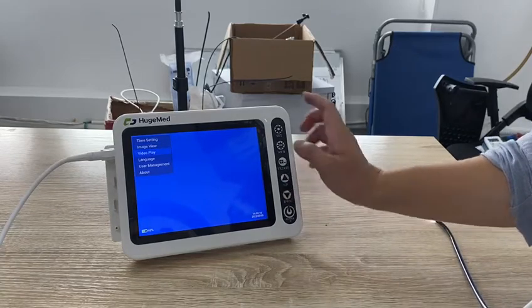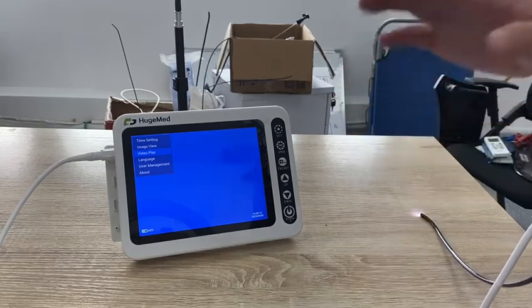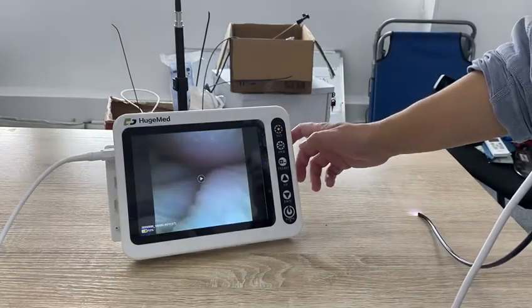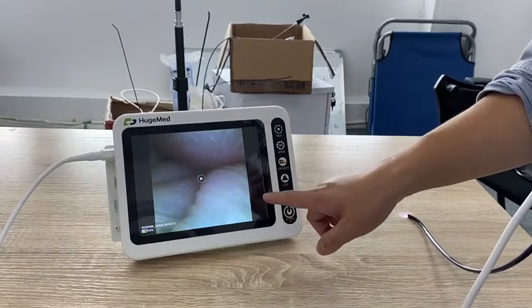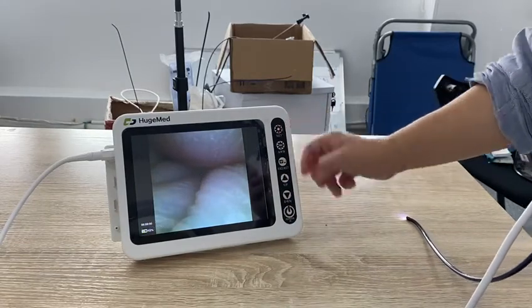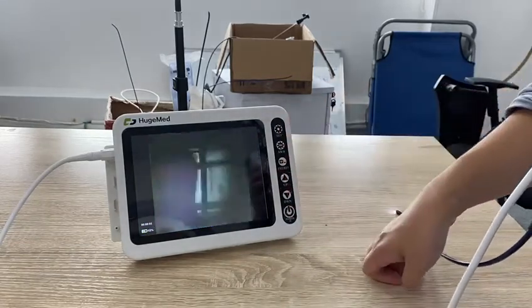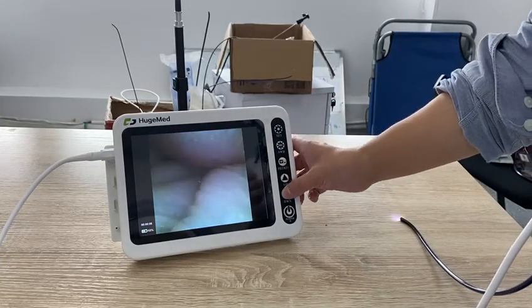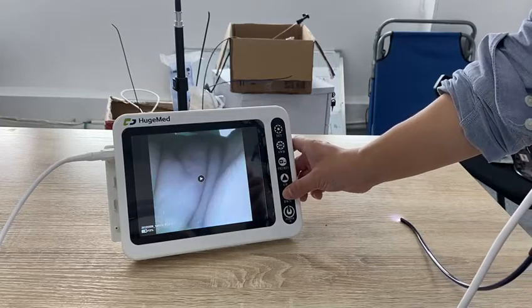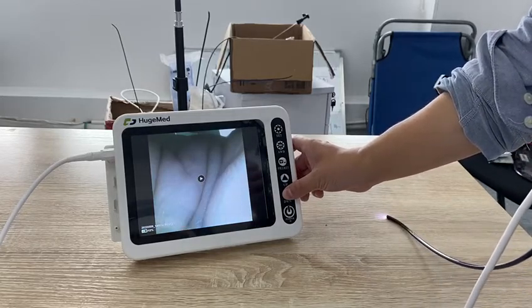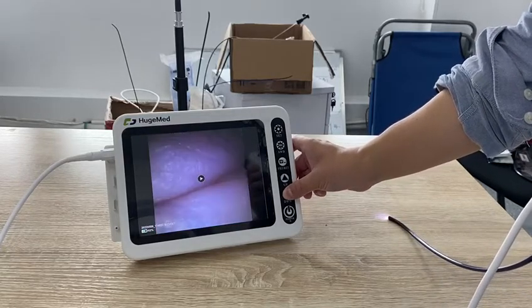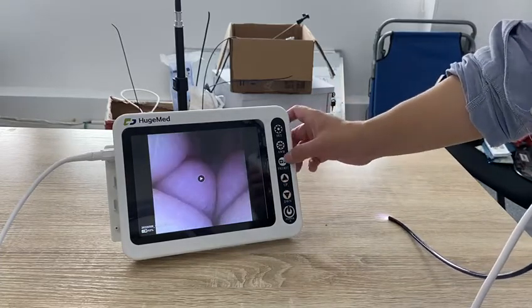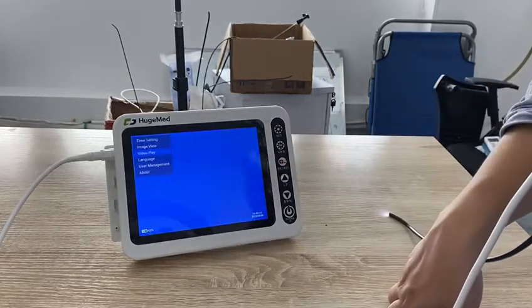Here is the video play section. We can view all the videos we took, including the video we just recorded. Press the set button to play it. If you want to go to other videos taken earlier, use the down and up buttons. Press freeze to exit.